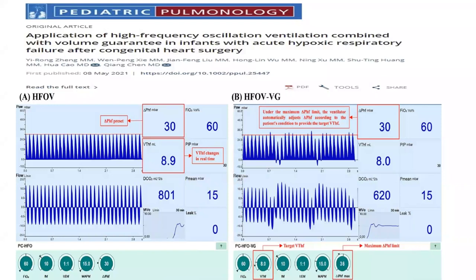Yeah, in one of the conferences, I visited the company's booth and asked them a similar question. I didn't ask why you are the only one. I asked why you are not changing the interface, why you're not having more. Some of the knobs are very sensitive. You change it a little bit and the numbers go very high for a small baby. He said we keep on with our research. It looks like they have some minor ongoing research, which they upgrade, or they continue their patent. So it's a matter of patent registration. My feeling is that no other company can use it, so it's exclusive to the patent owner.